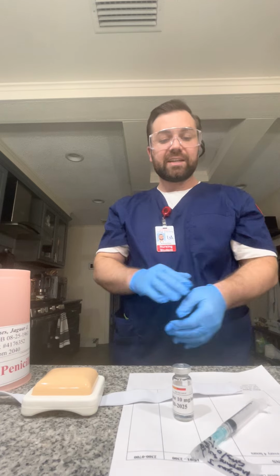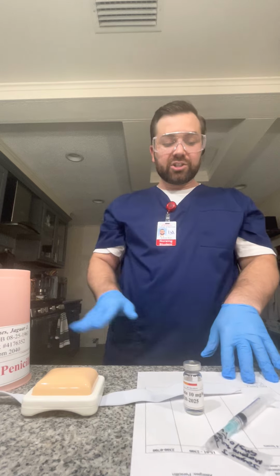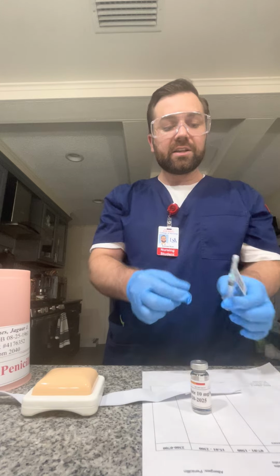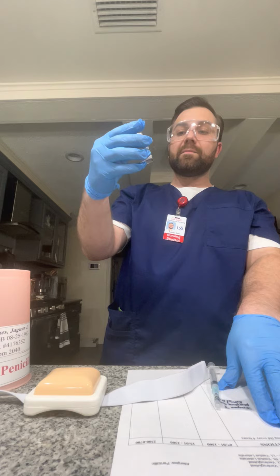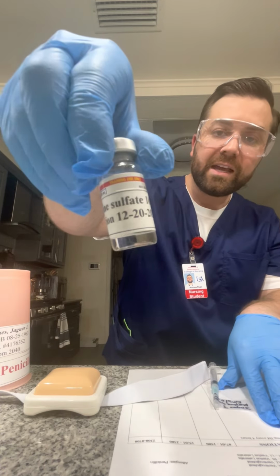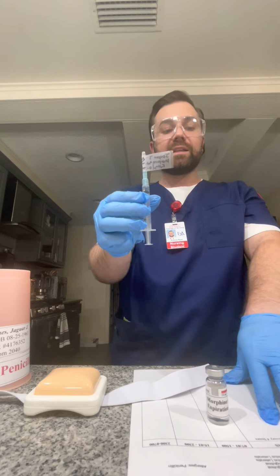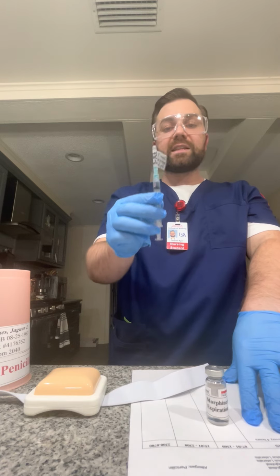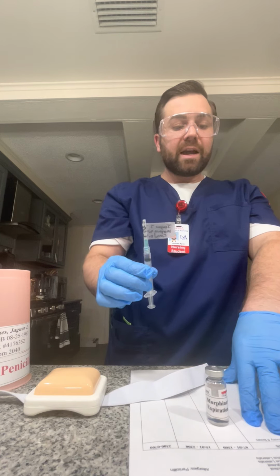And then now I'm going to do my last check. So I did check that you are Mr. Jaguar J. Jones. I checked your medical record number, and now we're going to check the drug. So I have the right drug, morphine sulfate, per the MAR, and I pulled up the morphine sulfate from this vial, 10 milligrams per milliliter, which after doing the calculations was 0.5 milliliters, confirming it with another nurse for the right dose, which was 5 milligrams, and then doing the conversion is 0.5 milliliters. All right, so we know that that's correct. And then the right route is an intramuscular injection.